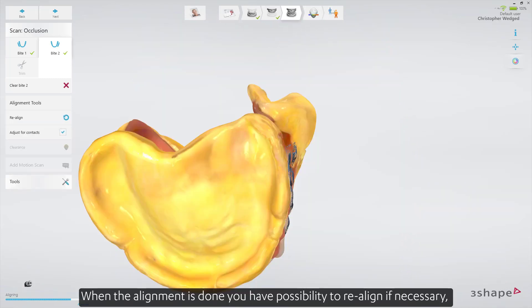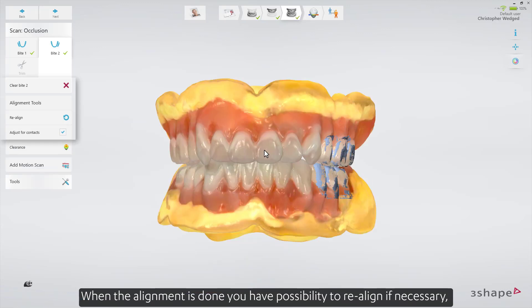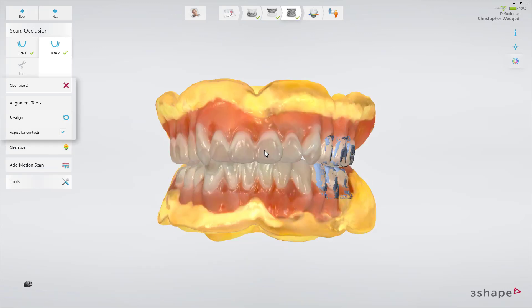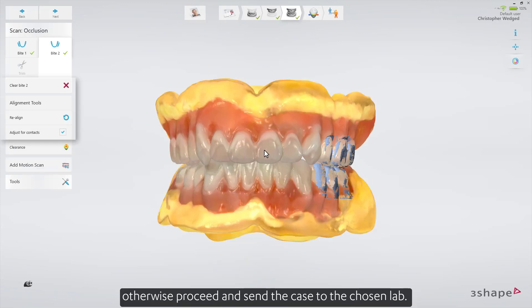When the alignment is done, you have the possibility to realign if necessary. Otherwise, proceed and send the case to the chosen lab.